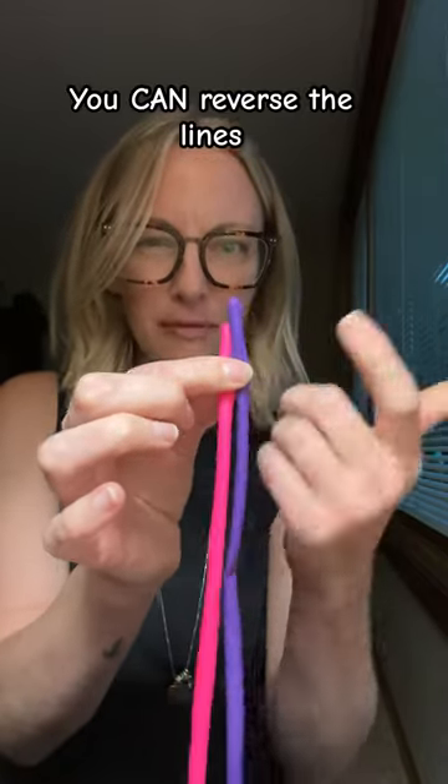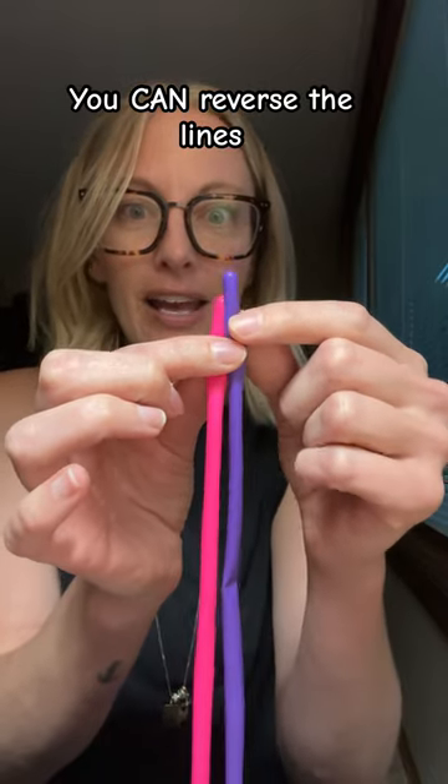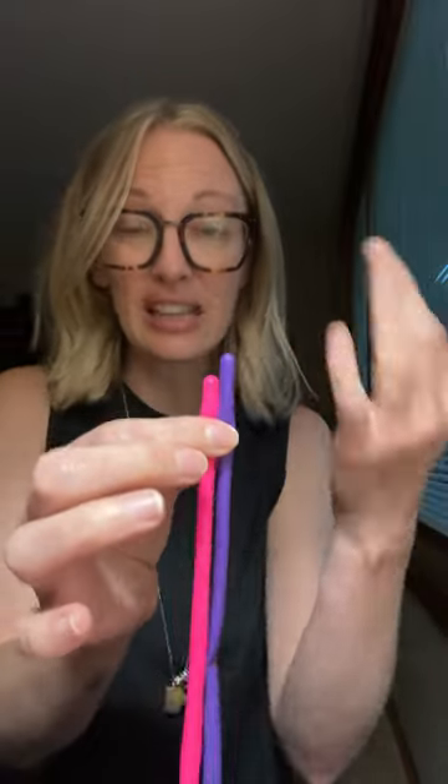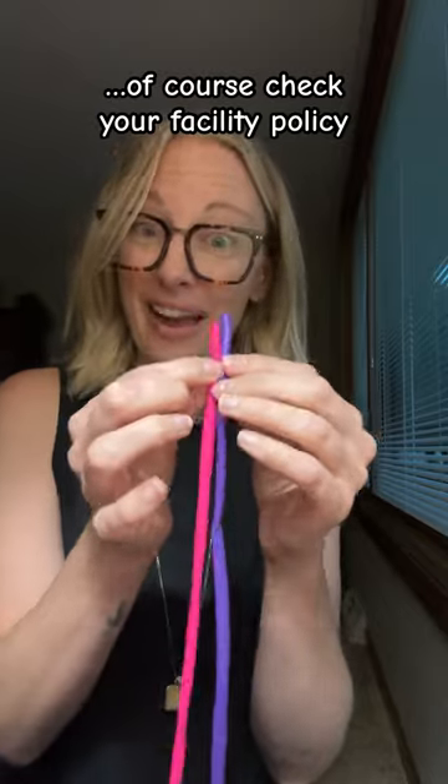So then we say, let's reverse the lines. Now we're going to start pulling from the blue line, and generally we get better flow from doing that. You're going to get less alarms, better blood flow, and tolerate dialysis better. So reversing the lines is okay.